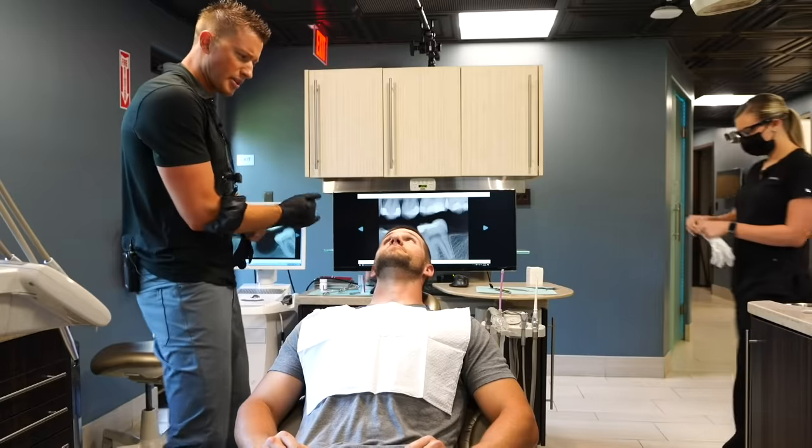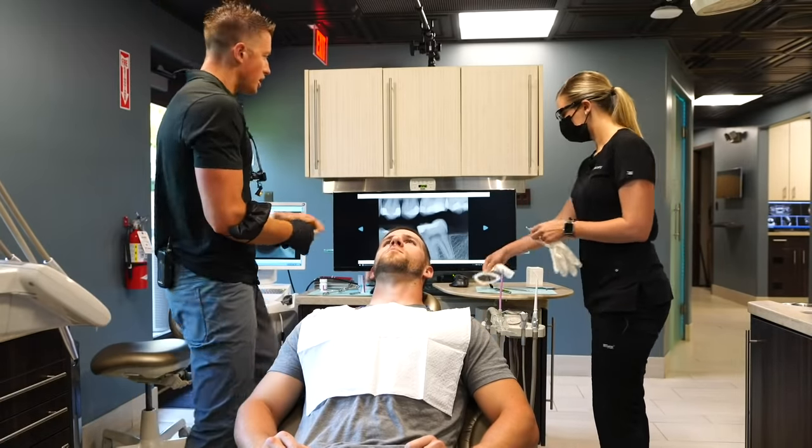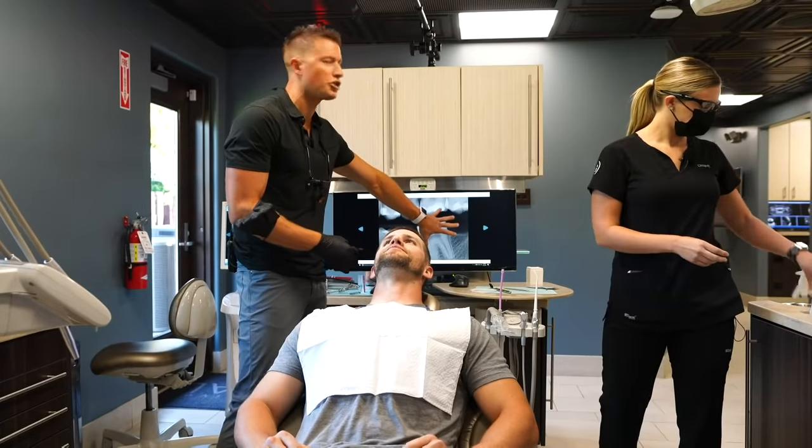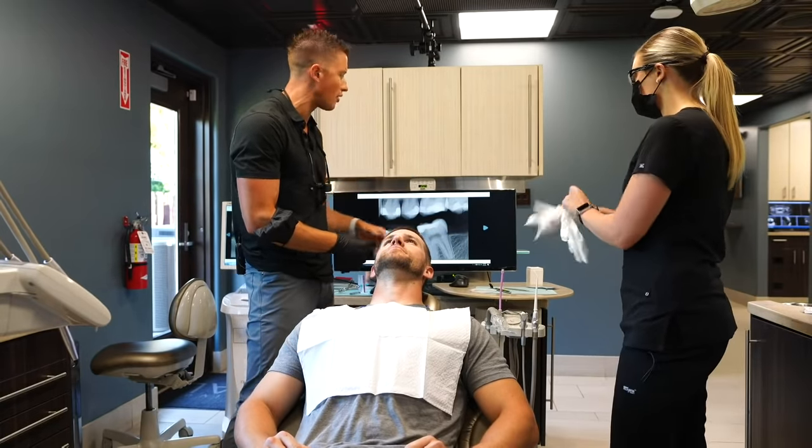How long have you been missing this tooth? I took it out about two years ago. Okay. So we're getting a little bit of drift. It's where the tooth behind will shift forward and the teeth above will start to drift down.